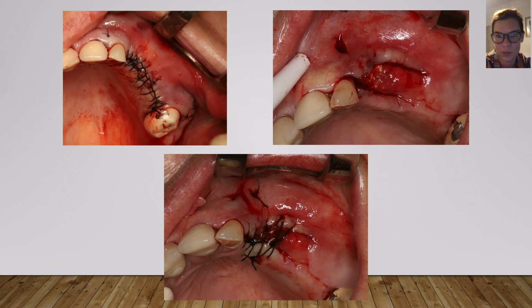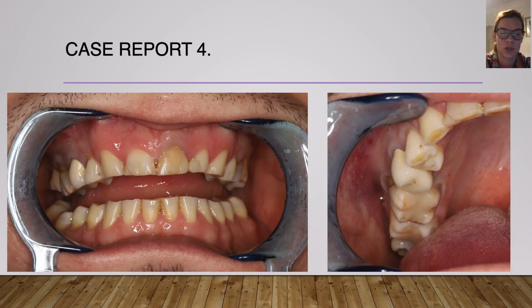the non-resorbable membrane. And when I removed the membrane, you could see that there is the formation of the new bone, so there is a callus formation. So right now we have to wait only for the mineralization of this area. So I decided to place a collagen membrane on the top of it and close it as I could, and we are waiting for the per secundum healing in this area and for the mineralization.